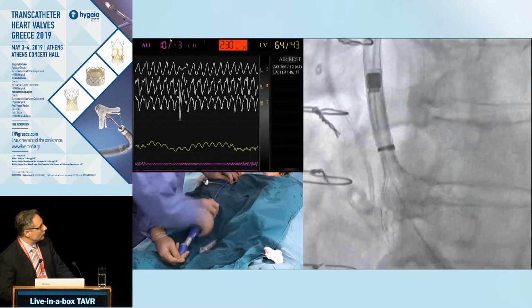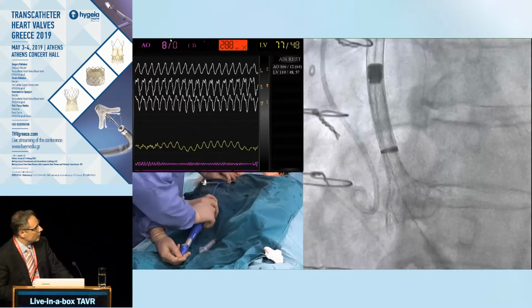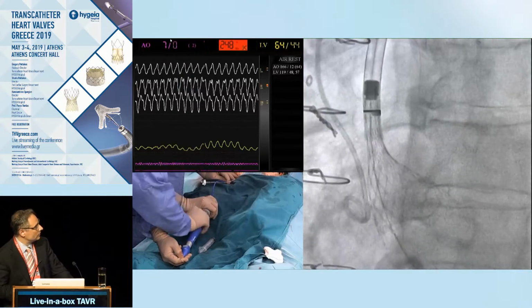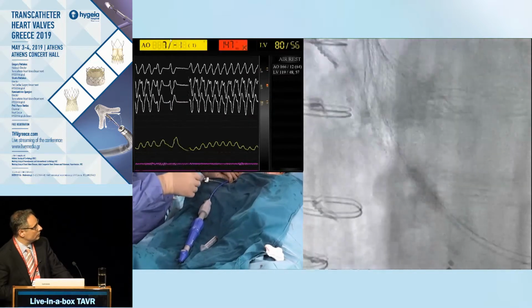And because of the deep implantation, we did a partial recapture once here, trying to stabilize and a little bit withdraw the valve at the same time. However, you see again that the deployment is a little bit low, deep into the LVOT.